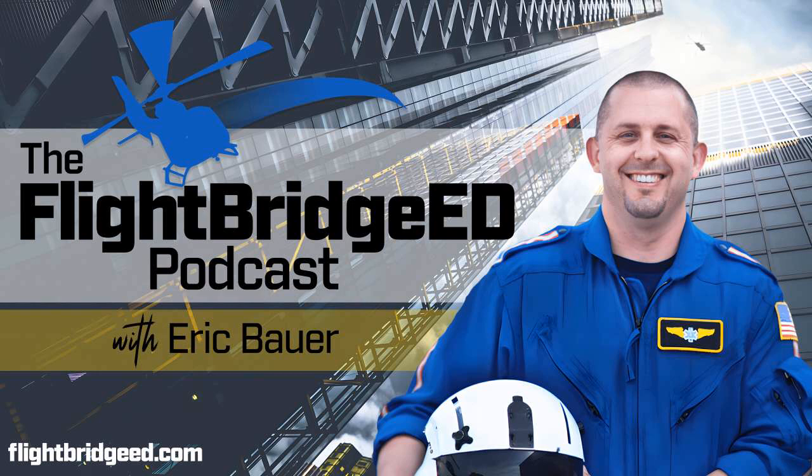Where you would only see those in guys like Shaquille O'Neal, for example. And again, I'm just joking, but you had these big, massive balloons, and those were only reserved for these larger, taller patients, and these were based on, obviously, height. And now you're seeing these bigger balloons. So why do I want to know?